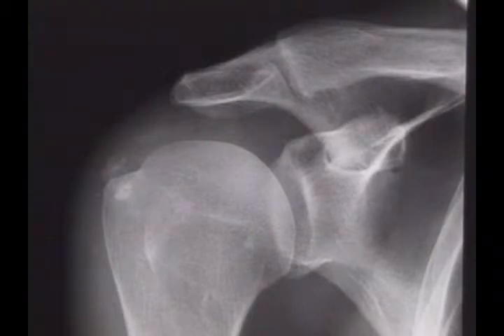Observe at the same time, 1, that the acromio-humeral window is opened, and 2, the tuberosity is preeminent. The amount of filtration is adjusted from the zone where the shadow of the shoulder falls. But here, take care, since a straight beam obscures the acromio-humeral window.